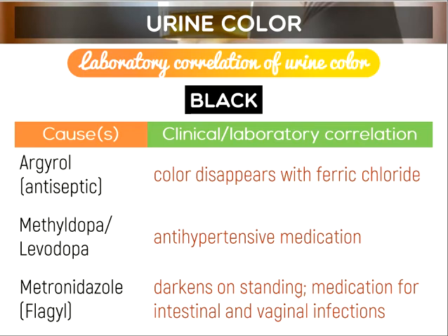Take note, guys, the color of the urine is directly proportional to its concentration, whereas the color is inversely proportional to its volume. Very good, guys.